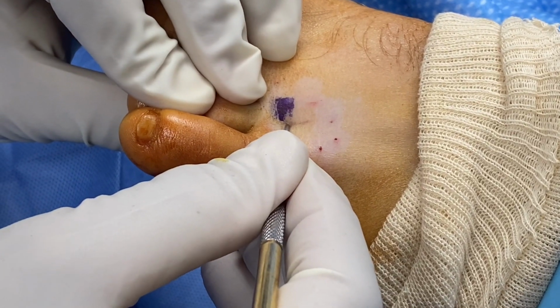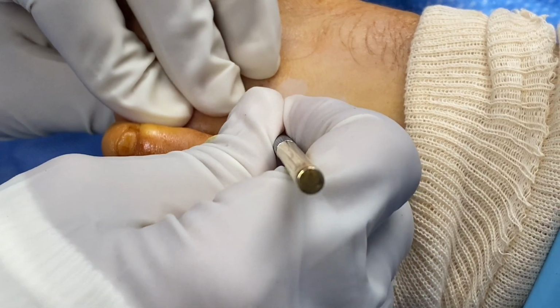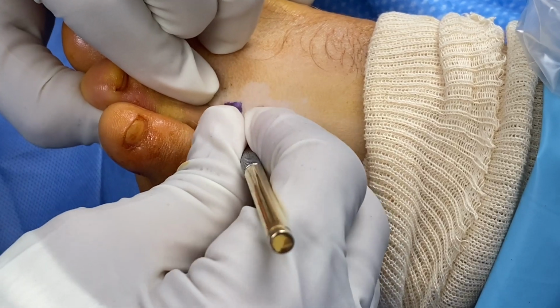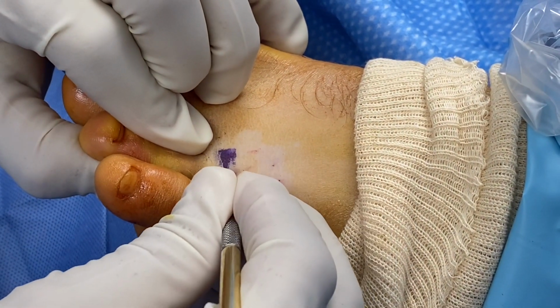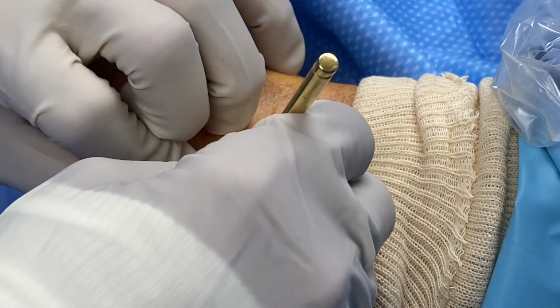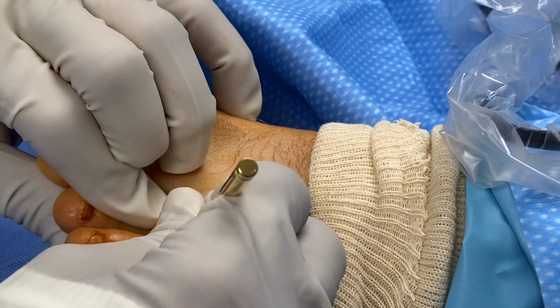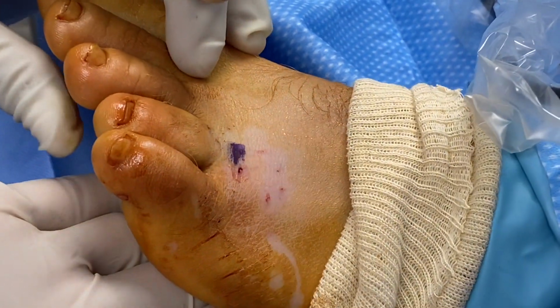The first thing that we want to do is release some of the soft tissue structures. Again, we're dropping the 4th toe. We get inside the joint. We want to release around the joint. There are some very important structures that we want to release, and that's exactly what we're doing first. You have to remember that this toe has been like this for 30 years. I've always said that these toes have a mind of their own. Now watch this. Boom.